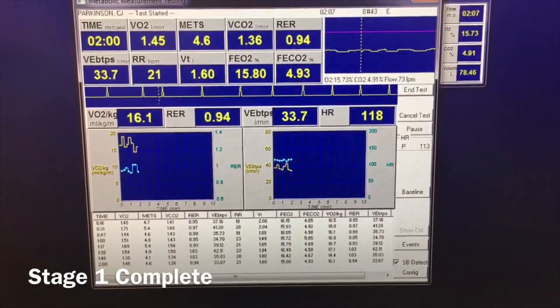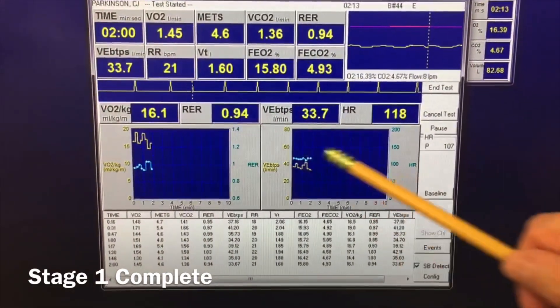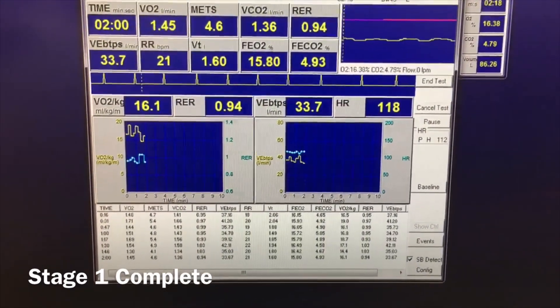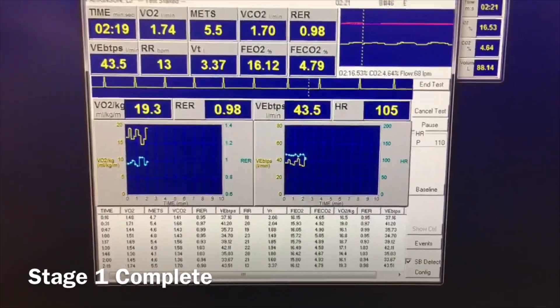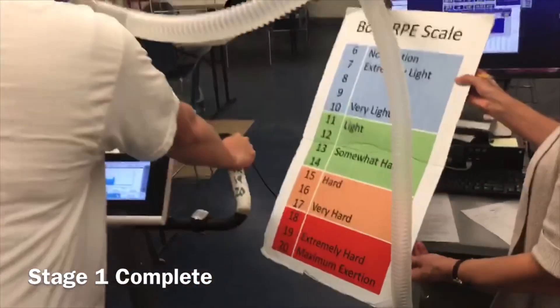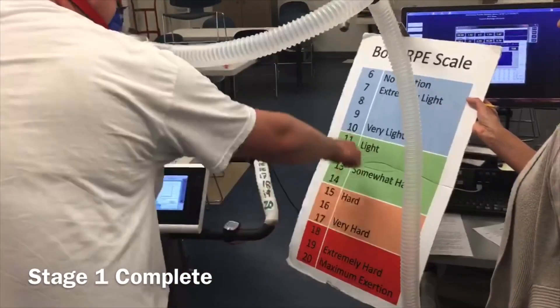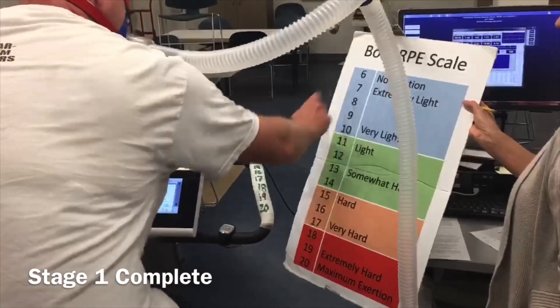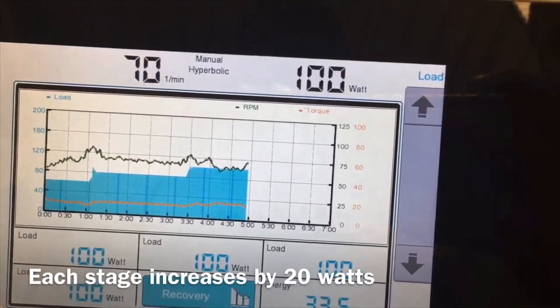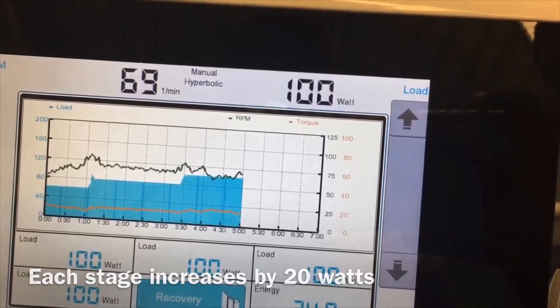At the two-minute mark, we're going to take our data, look at the RER value, look at the heart rate value, and then ask him what his RPE is. We don't want him to talk, but we want him to point to the tape on the bike to tell us. Stage one was 80 watts. On stage two, we're going to do 100 watts. Stage three will be 120 watts. We keep going until volitional exhaustion.